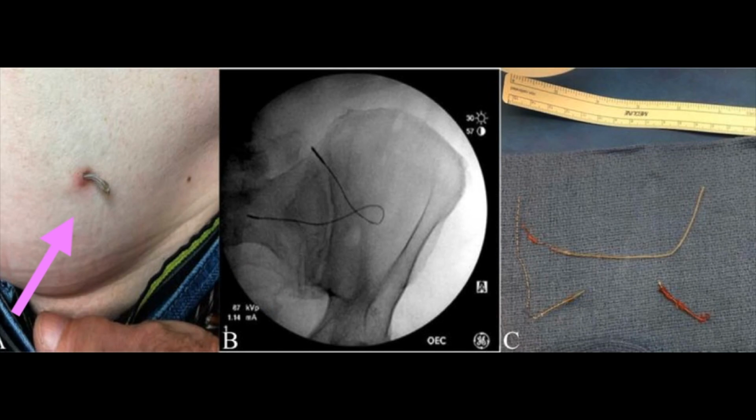Here's a nerve stimulator gone bad, where it's protruding from the skin. This is the x-ray of the stimulator before removal. And here is the removal of the fractured stimulator lead.